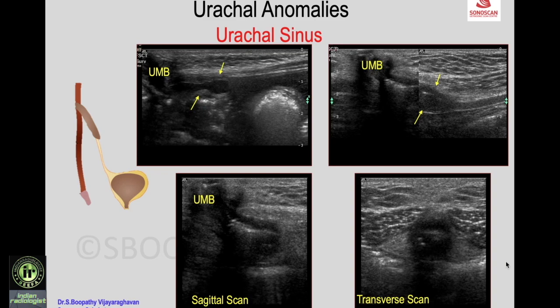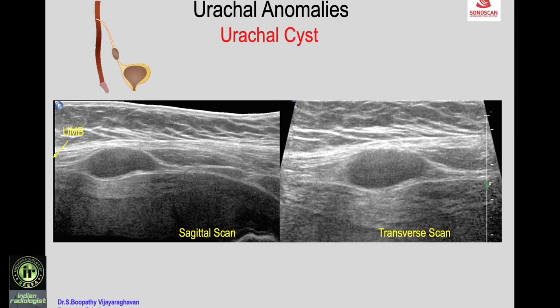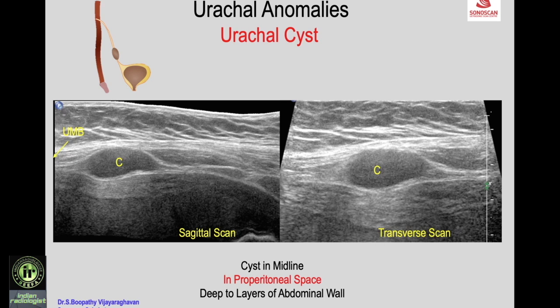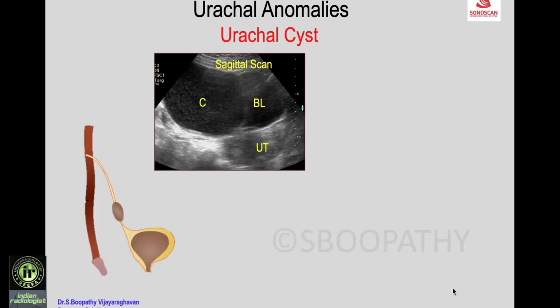A urachal cyst can occur anywhere along the tract. On longitudinal scan, an oval cyst is seen in the preperitoneal space between the umbilicus and the bladder, confirmed on transverse scan — a urachal cyst along the midline in the preperitoneal space, deep to the layers of the abdominal wall.